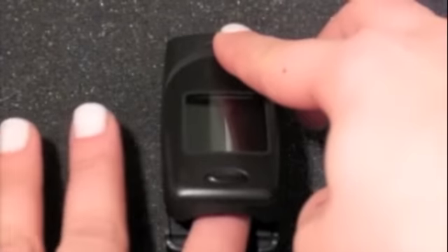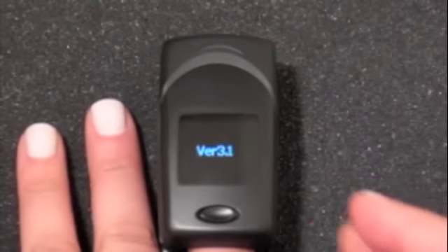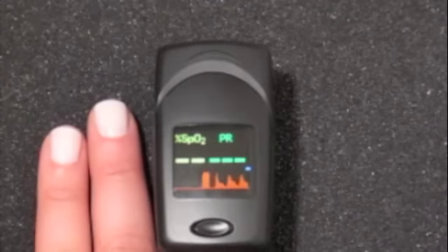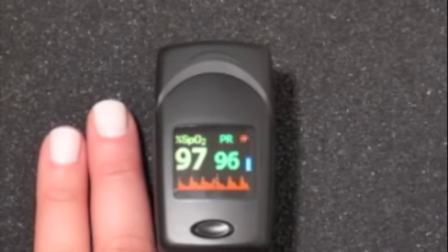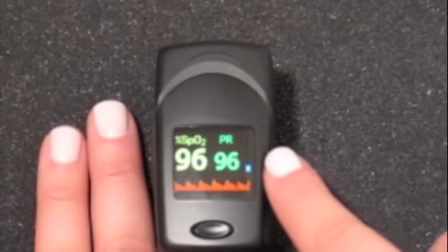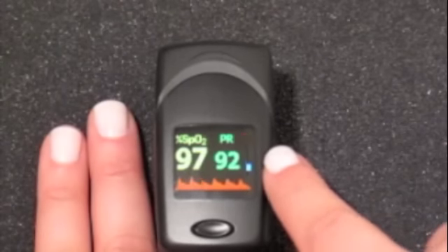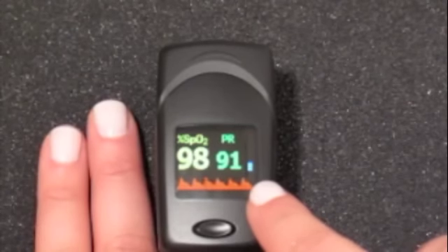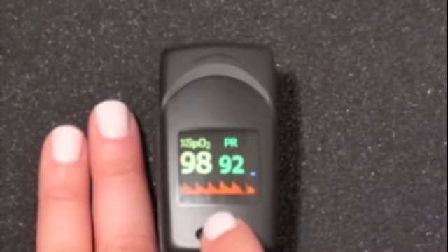Simply place your finger inside the oximeter. The organic light-emitting diode color screen automatically lights up and within seconds gives you a continuous accurate reading of SpO2, blood oxygen saturation, pulse rate with a pulse bar, plethysmograph. Holding the power button will display perfusion index.